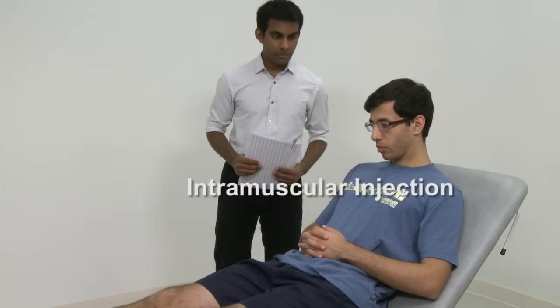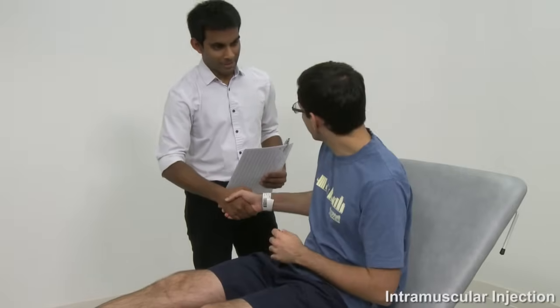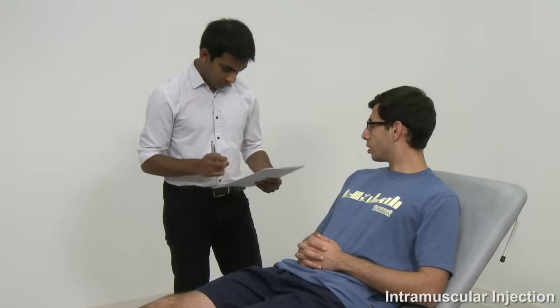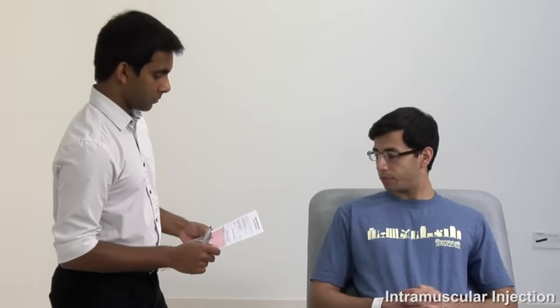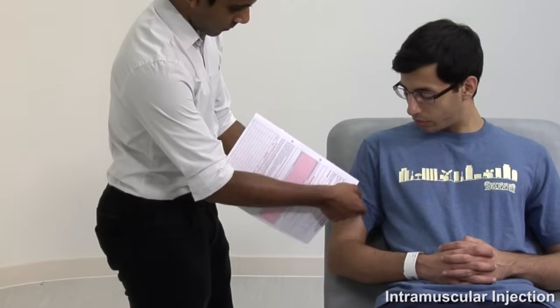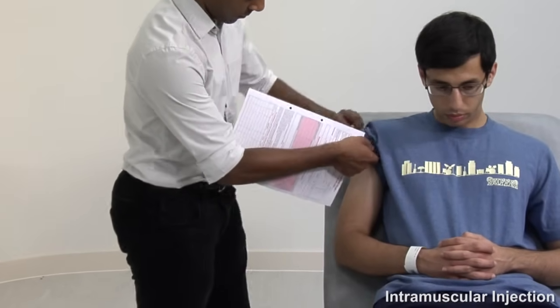In addition to the usual introduction and consent process, be sure to re-check whether the patient has any allergy to the drug you are about to deliver, as well as ensuring that the drug you have selected matches what is written on the prescription. You should also record the batch numbers and expiry date of the drug in a suitable location, usually a ward register or the patient's notes. Now identify a suitable site for injection, usually from one of the three previously mentioned, then thoroughly wash your hands.